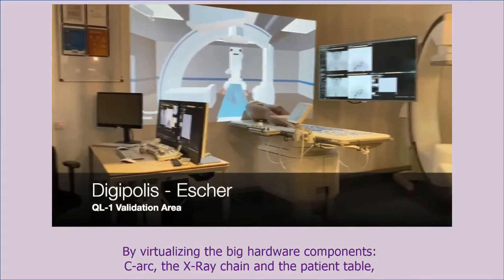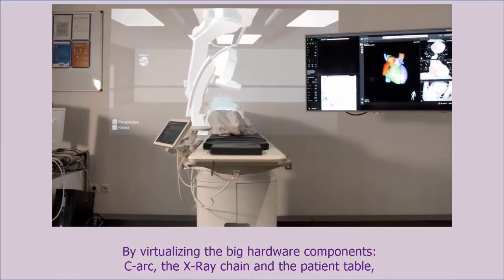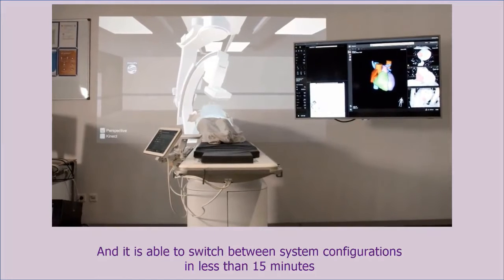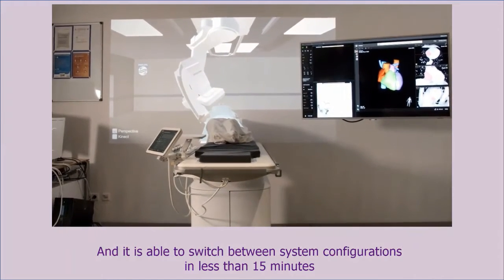By virtualizing the big hardware components, C-ARC, the X-ray chain, and the patient table, the virtual test platform holds multiple system configurations in one, and it is able to switch between system configurations in less than 15 minutes.